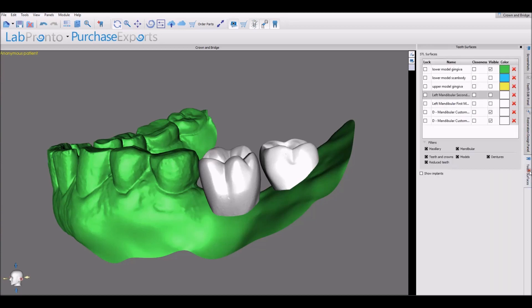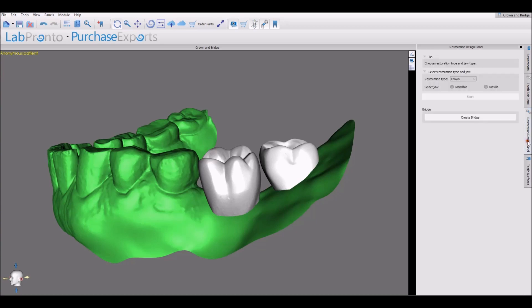First we make sure the relevant crowns are the ones that are active and visible, and then we click Create Bridge.